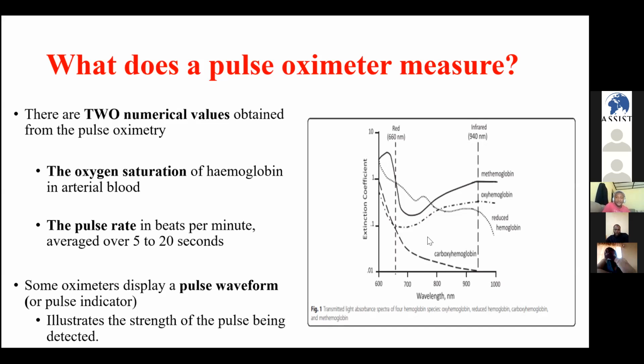On the contrary, in the infrared band, the oxyhemoglobin will absorb more light than reduced hemoglobin.